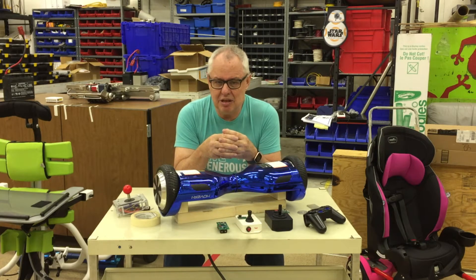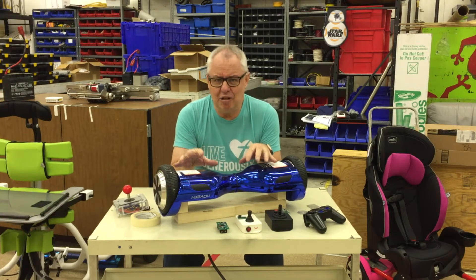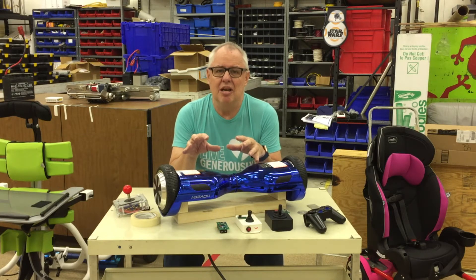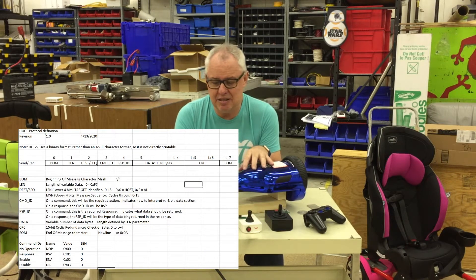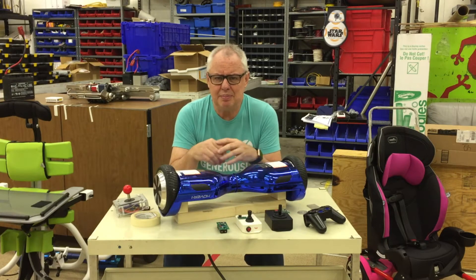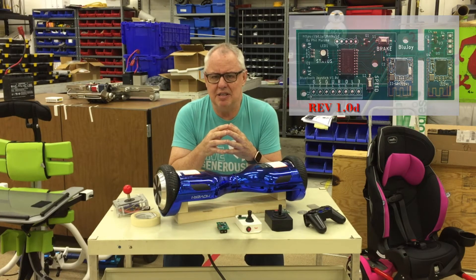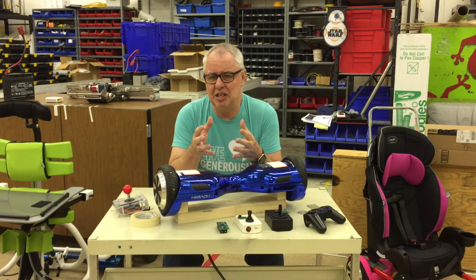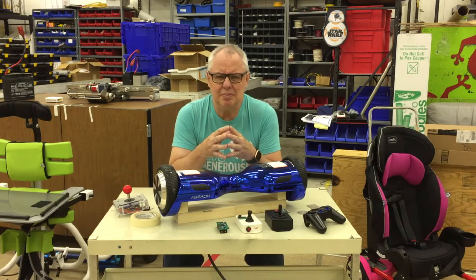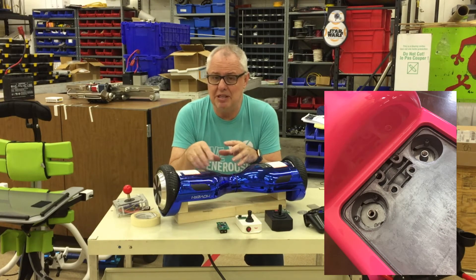This meant designing custom electronics, new software elements and new mechanical components. I chose a reliable and readily available hoverboard brand and adapted the internal software to support a standard control protocol that I've called HUGS — Hoverboard Universal Gateway System. This replaces the self-balancing software that would normally be inside the unit. I then created a custom digital circuit that can be used to accept movement commands from external control devices. These devices can be either hardwired or wireless, and my design works with any generic joystick that uses either switches or potentiometers. I've also developed a hardware mounting system that can be retrofitted to the hoverboard to provide a simple yet robust mounting method.